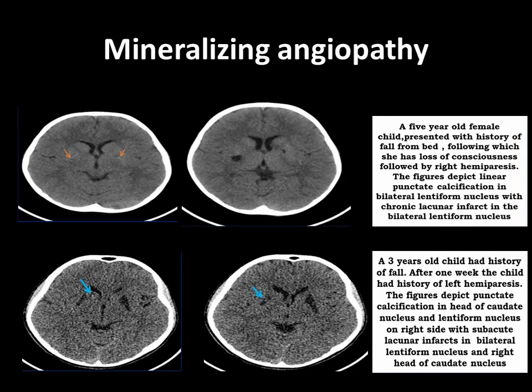Here is a case of a five-year-old female child who presented with a history of fall from bed, following which she had a loss of consciousness followed by right hemiparesis. The first set of figures depict linear punctate calcifications in bilateral lentiform nucleus with chronic lacunar infarcts in bilateral lentiform nucleus.